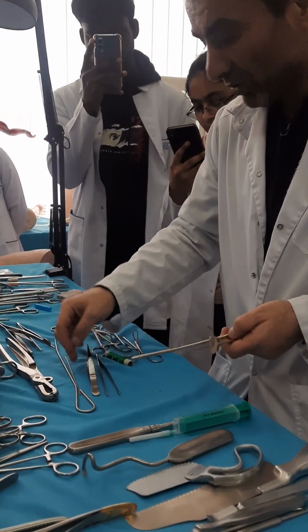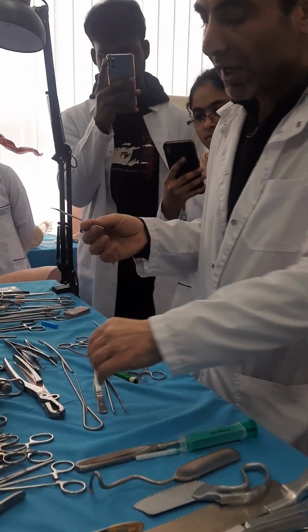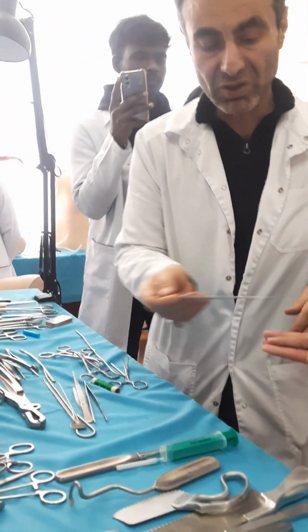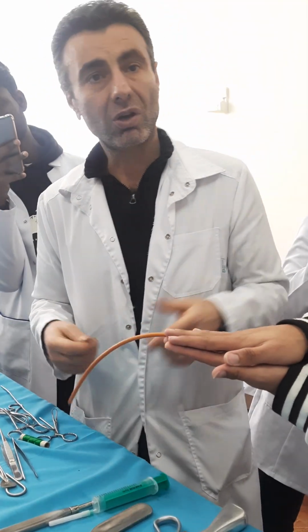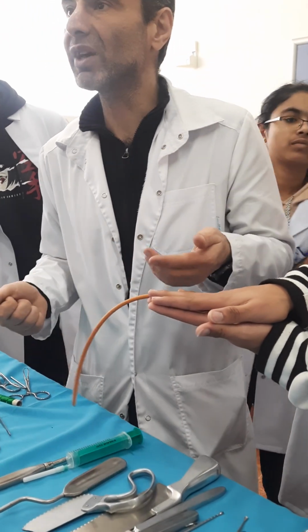Size, of course, can be different: small, big, short, long. So this is a unique type of probe. We call it the grooved probe. Now hold your hands like this. For example, this is two layers which I want to cut. And I know that between these two layers there are vessels or nerves. I teach you the first rule of dissection: cut the tissues layer by layer.